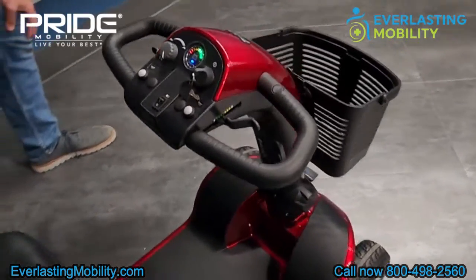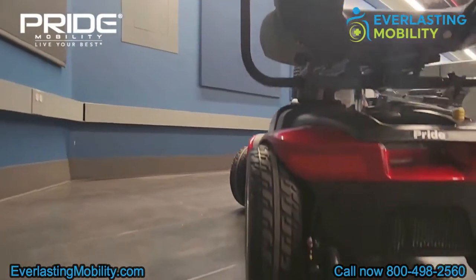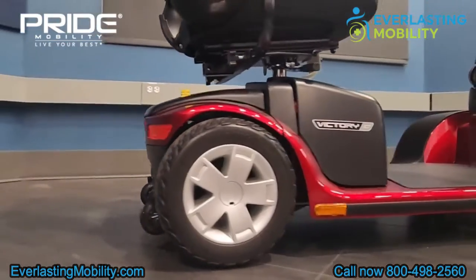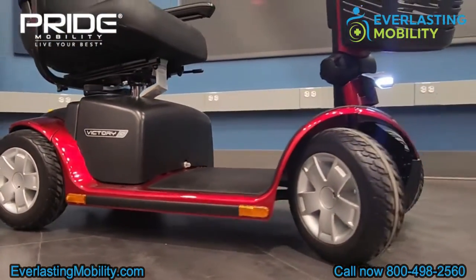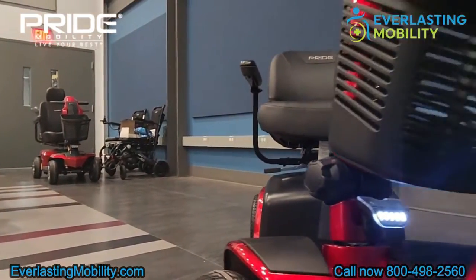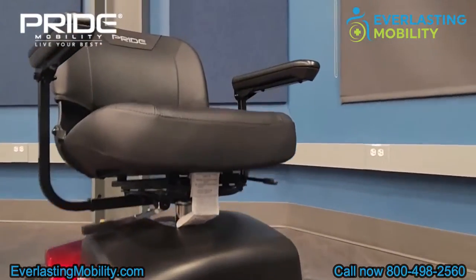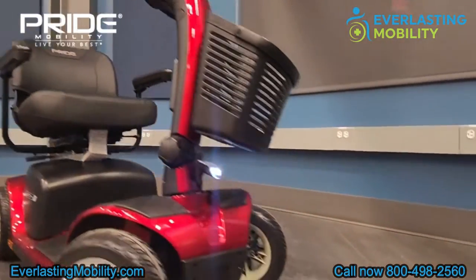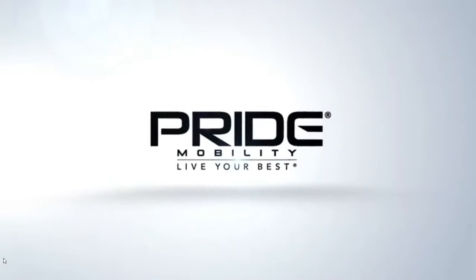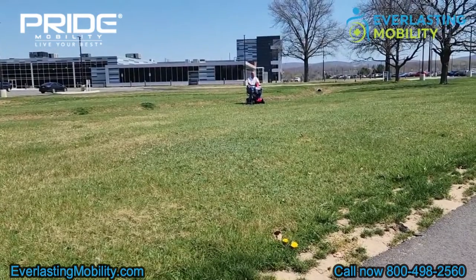On the front of the scooter, there is a large basket that you can remove if you want to take it with you when shopping. All in all, it's an excellent scooter. The Victory 10 is one of the more popular scooters within Pride Mobility's mobility scooter line, and if you're looking for an excellent heavy-duty mobility scooter that is priced well, the Victory 10 is an excellent choice. We love working with Pride Mobility — they're one of the best powered mobility brands in the industry.